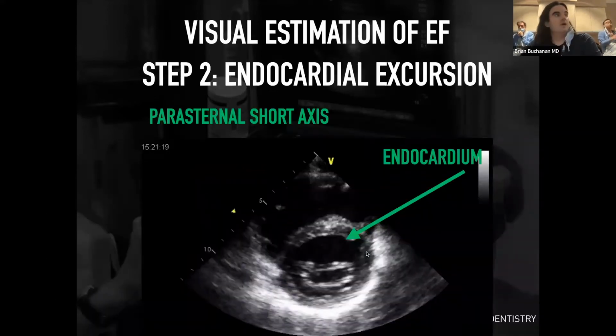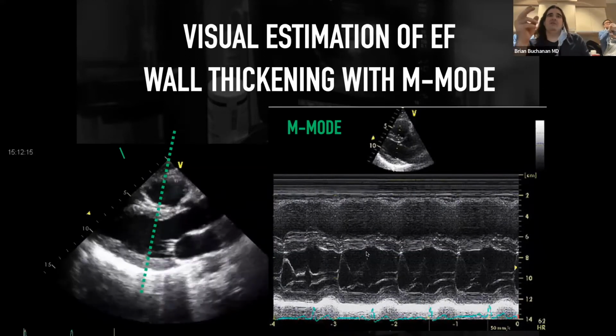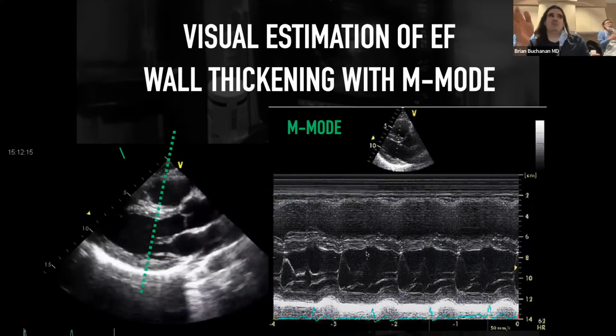You find that looking at M mode as a collective view after multiple views contributes to, or hinders, making that overall assessment? No, I mean, I think if you have a few solid views, I'm not sure how much it really helps.